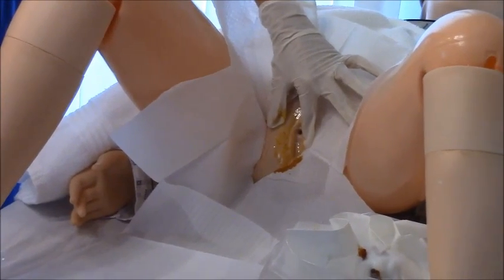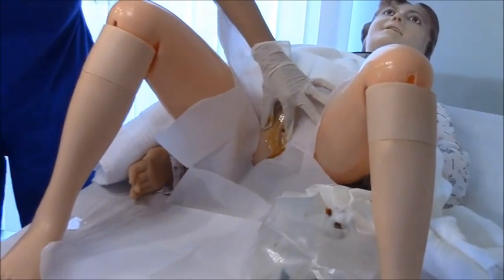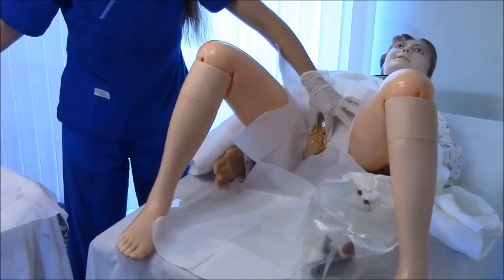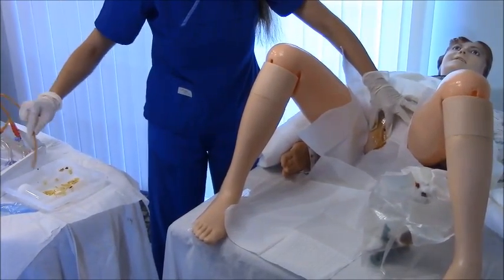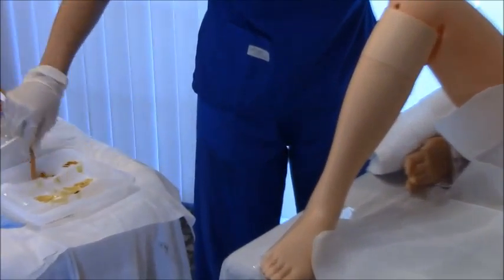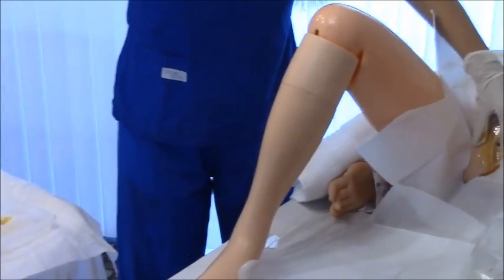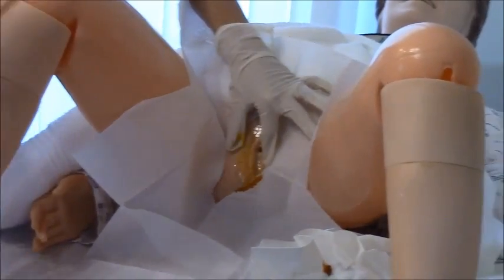Next, get your Foley catheter and be very careful removing it. Take the insertion end and lubricate it well — really dip it in the lubricant and get it nicely coated. Then bring it to the patient and find the urethra. On many female patients this can be challenging because the urethra can be displaced up inside the labia and is hard to see. Sometimes the catheter gets inserted into the vagina by mistake, so it takes practice.